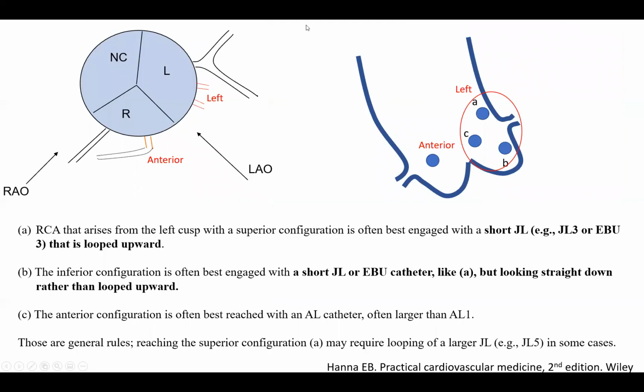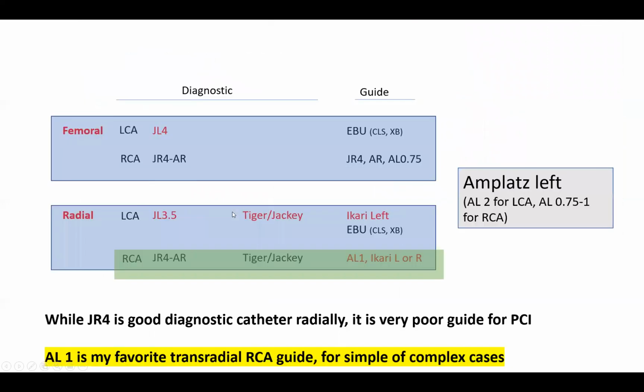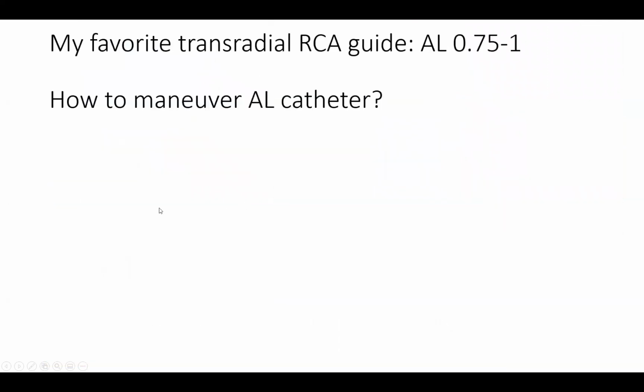Okay. If there are no questions, I will move to the next topic here, which is how to maneuver Amplatz left, engagement and disengagement. And I will also describe some other guiding catheters.